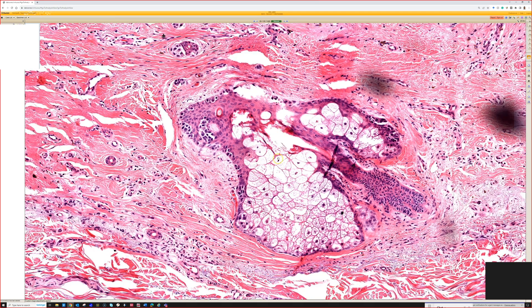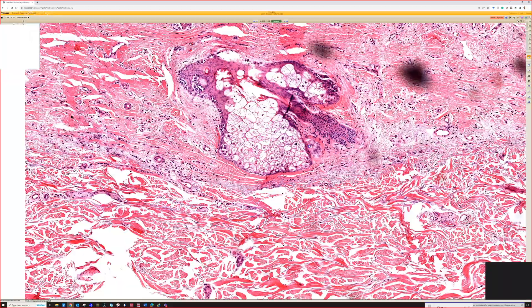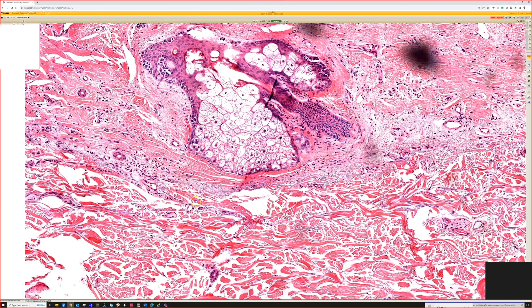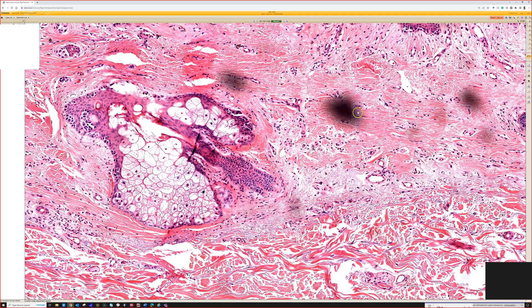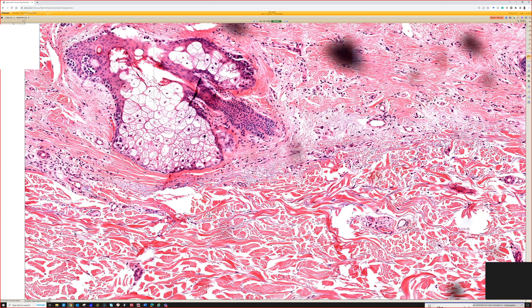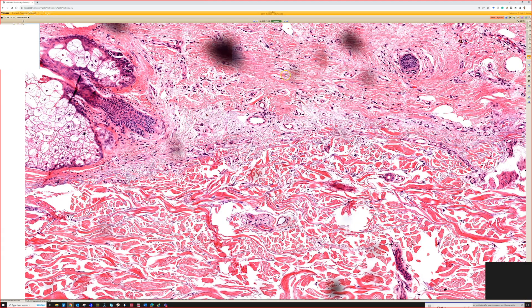This patient was probably older with some sun damage, so their solar elastosis has been pushed down by the collagen up here. In sun-damaged patients, if you see scar-like tissue or an atypical melanocytic proliferation pushing elastic fibers down, that means it grew after the person got old and sun damaged. New atypical melanocytic lesions that are thick and pushing down elastic fibers — or scar-like material pushing down collagen indicating something grew and then regressed — are very concerning for melanoma.